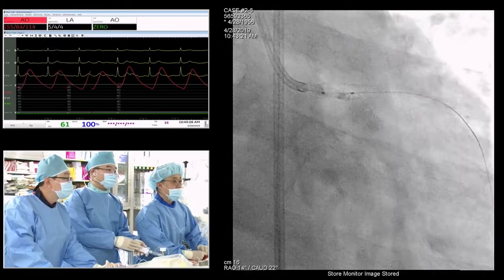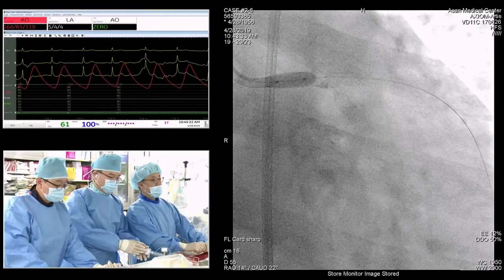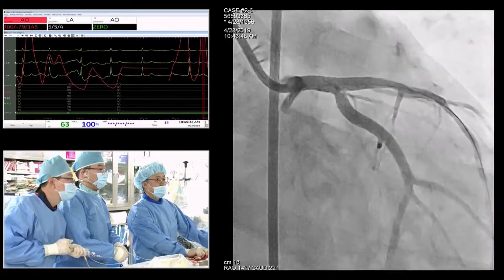Okay, go. 6, 8, 10, 12. When I look at the fluoroscopic images, in the distal left main there is a more dense part, and it reflects the length of the two layers of the stent. Right. And then maybe recross the wire?